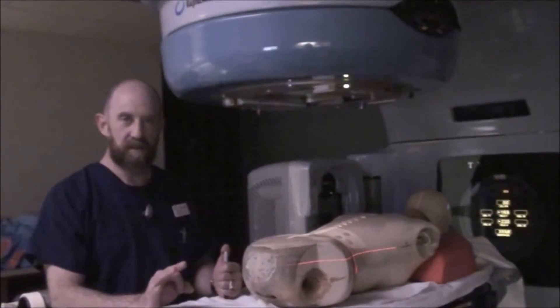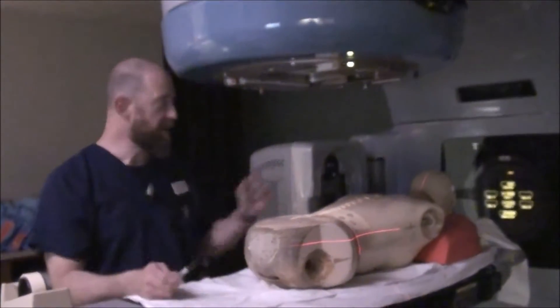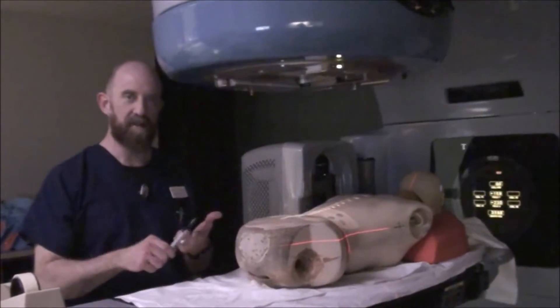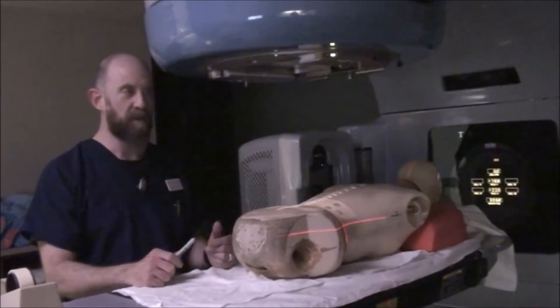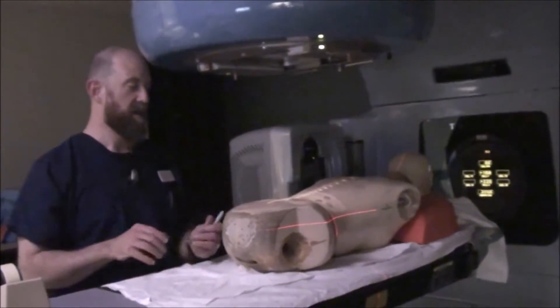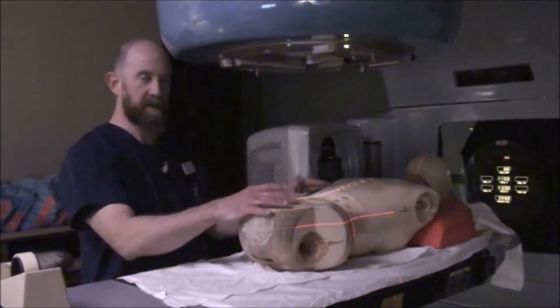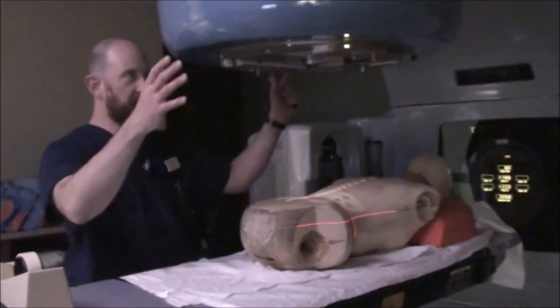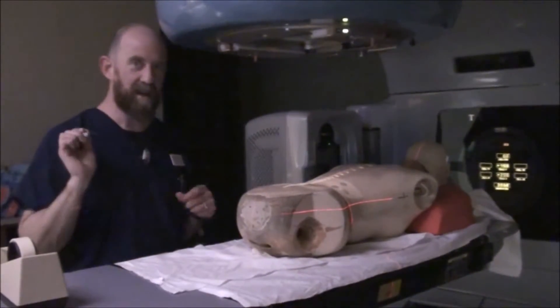There are at least three things to notate on every single patient before you run back in: collimator settings — field size and collimator angle — gantry angle, and table settings, meaning where the table is in space: in, out, left, right, up, down. So: collimator, gantry, table settings — every time. In this particular case it's a plain PA field, so notate everything — your lat and long for the table, the collimator and gantry angles, and the field size. Then quickly come back into the room.